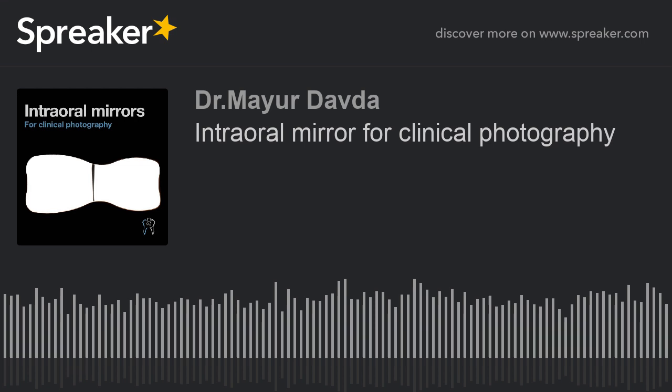Any mirror that you want to put inside the patient's mouth obviously has to be autoclavable. That's the primary criterion. The mirror has to be rigid so that it does not flex, because flexing can cause distortion. The mirror should be very thick so that apart from getting a good reflection, you should be able to do a little bit of retraction or achieve a little bit more of mouth opening. That's a primary requirement as well. For that to happen, you need to have the mirror which is contra angle and not straight. So just keep these criteria in mind before you invest in mirror equipment.